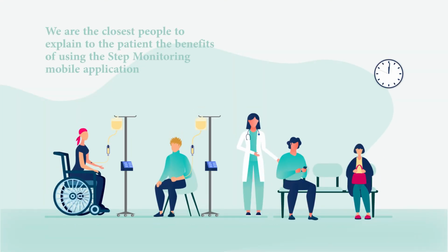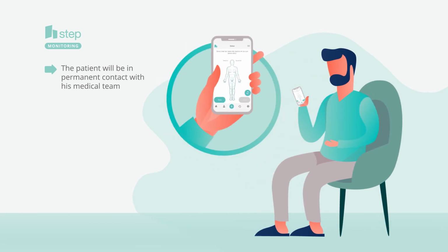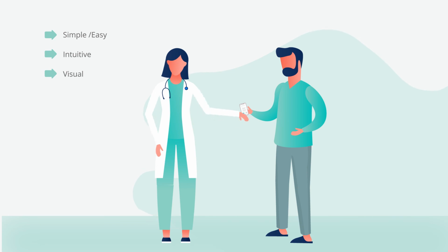As you can see, STEP monitoring is a very beneficial tool for our work, but also for patients. We are the closest people to explain to the patient the correct way to use this mobile application. But above all, we are the ideal people to convey the benefits of being an active part of the monitoring process. It is positive that the patient understands that with the simple help of their mobile phone or tablet, they will be even closer to and in more permanent contact with the medical team in charge of their case. It must be made clear that answering the questionnaires helps us detect complications early, and that this can help them feel much better throughout treatment and progress better. It is also advisable to highlight the added value of the simplicity of the application, intuitive and very easy to use.